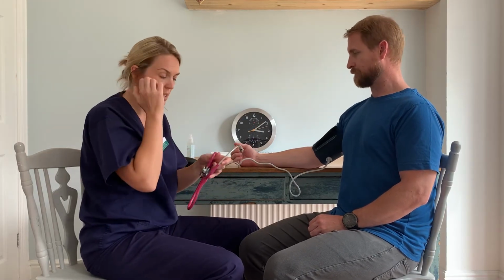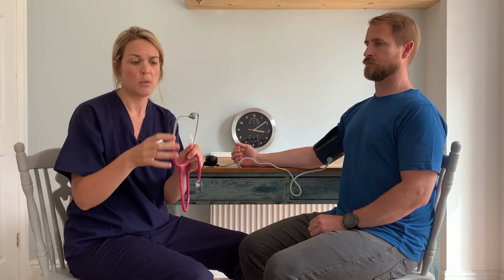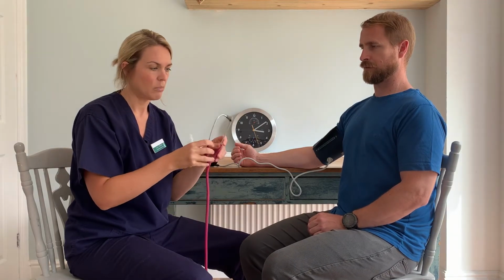So I'm just going to take my stethoscope, ensuring that you put this in your ears the right way round. So the earpieces need to go in your ears, pointing forwards to the end of your nose. If you put the earpieces in the wrong way, pointing backwards towards your ears, you won't be able to hear anything at all. So I'm going to point these in forwards to the end of my nose.